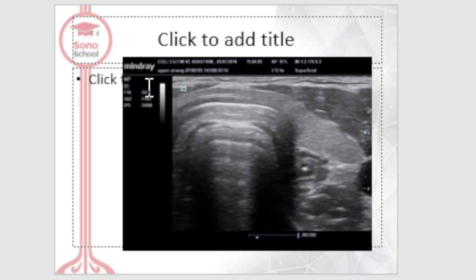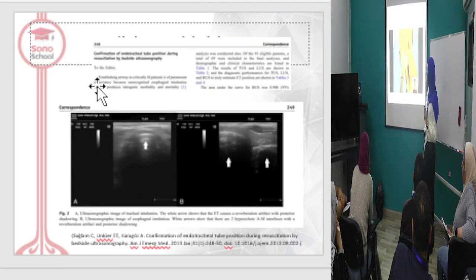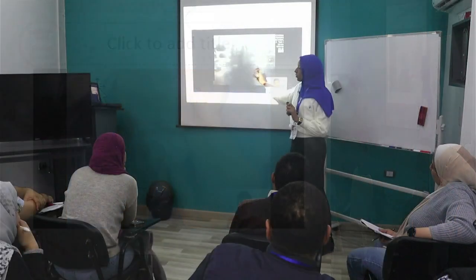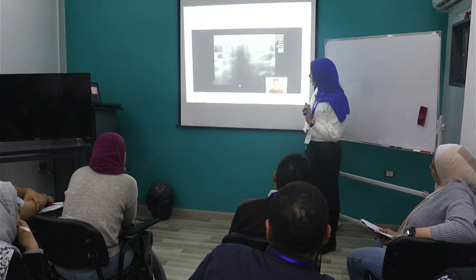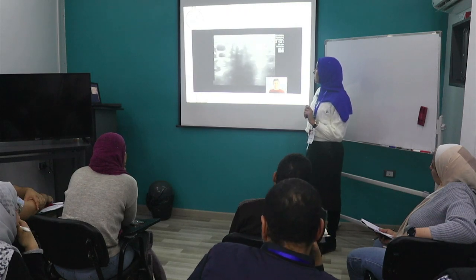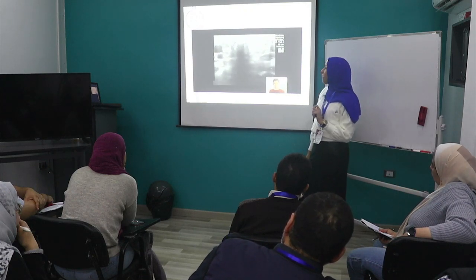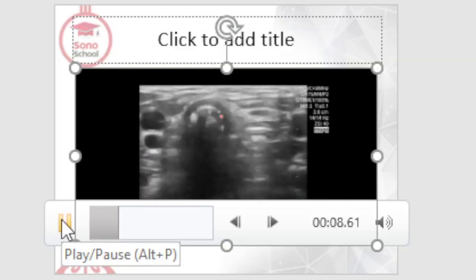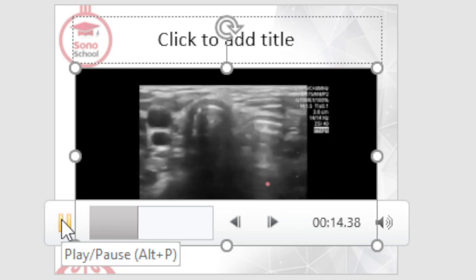While here, beside, to the left. This video will show you more. Artery. Air column, that is normally not present here. The esophagus is a collapsed organ. Yes, the left. Transverse.